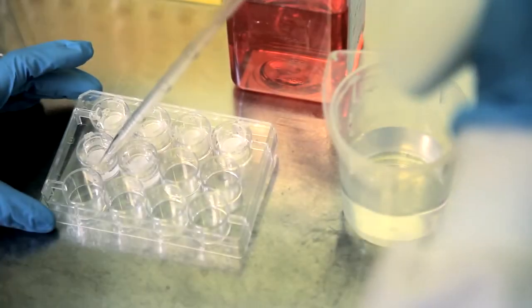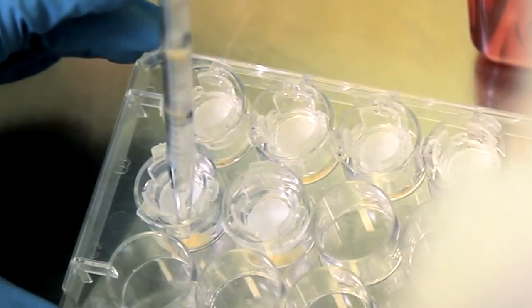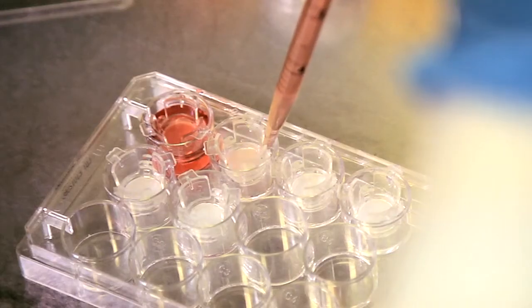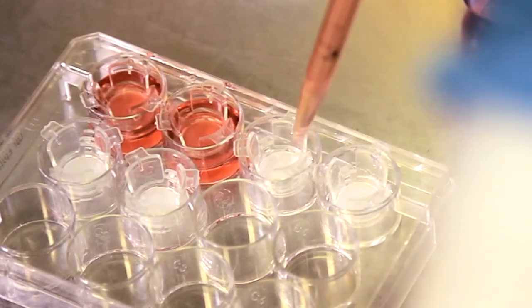If you're not treating the Alvatex with a coating reagent, then carefully remove the ethanol solution and immediately wash the Alvatex disc in PBS or the appropriate culture medium for approximately one minute. The volume of wash medium will depend on the product format you're using. Make sure to add enough so that the level of the liquid rises over the Alvatex membrane.